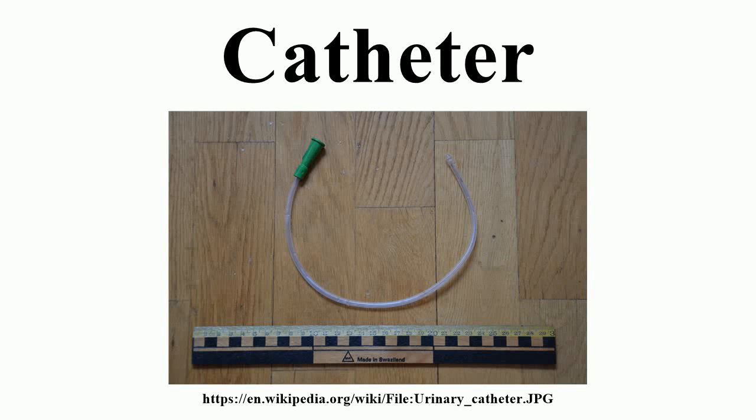In medicine, a catheter is a thin tube made from medical-grade materials serving a broad range of functions. Catheters are medical devices that can be inserted in the body to treat diseases or perform a surgical procedure. By modifying the material or adjusting the way catheters are manufactured, it is possible to tailor catheters for cardiovascular, urological, gastrointestinal, neurovascular, and ophthalmic applications.